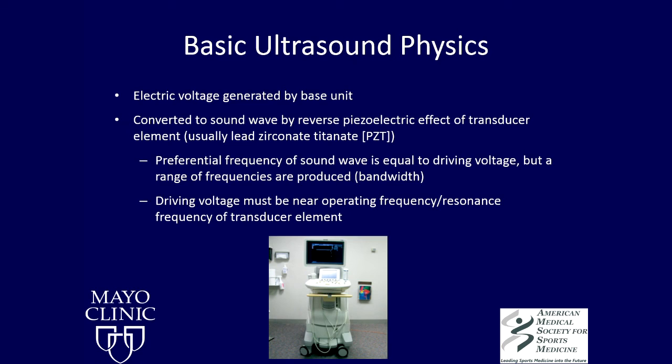So you're going to have a lot of different frequencies coming out from that reverse piezoelectric effect. The driving voltage must be near the operating frequency or resonance frequency of the transducer element to maximize the ability to convert the electric voltage into a sound wave in an efficient manner.